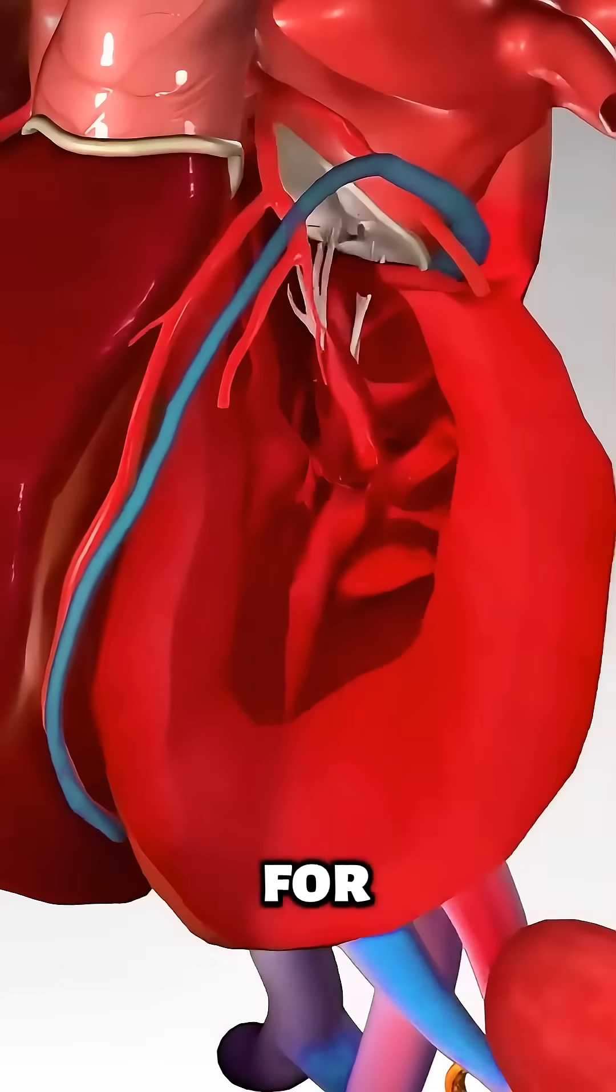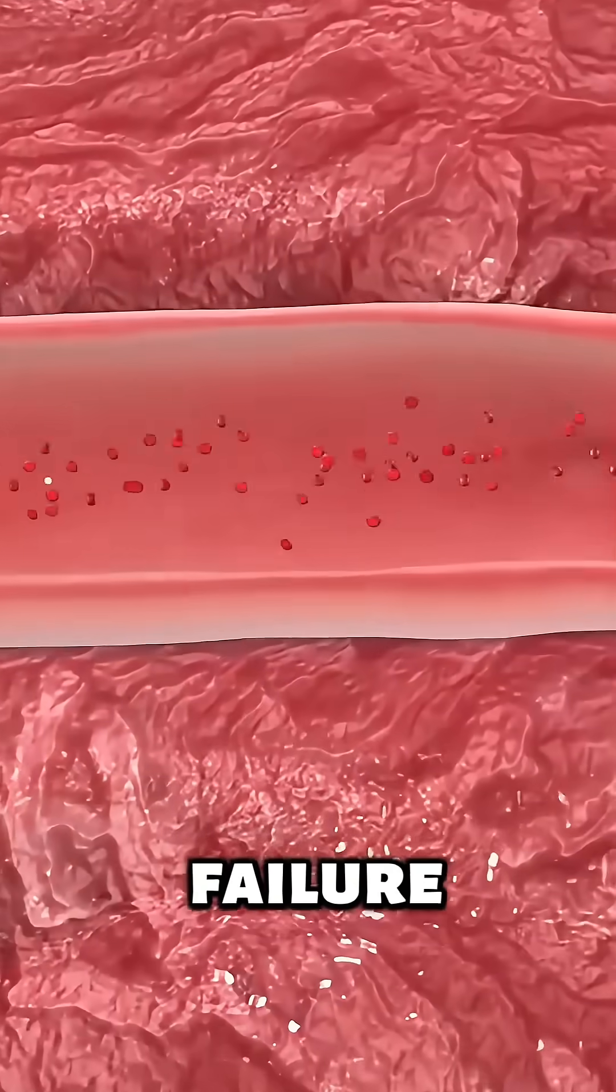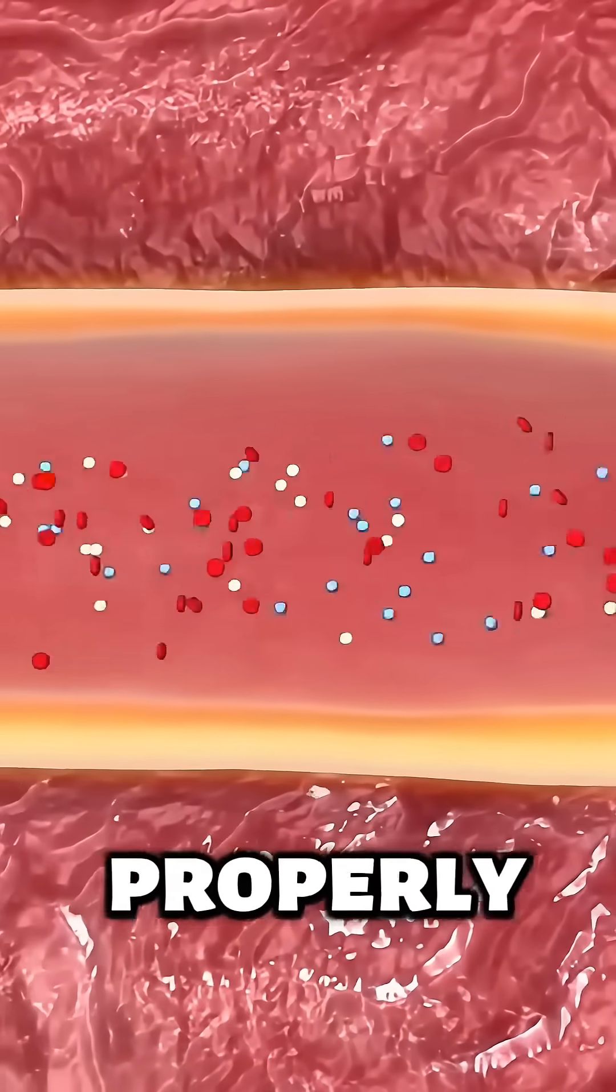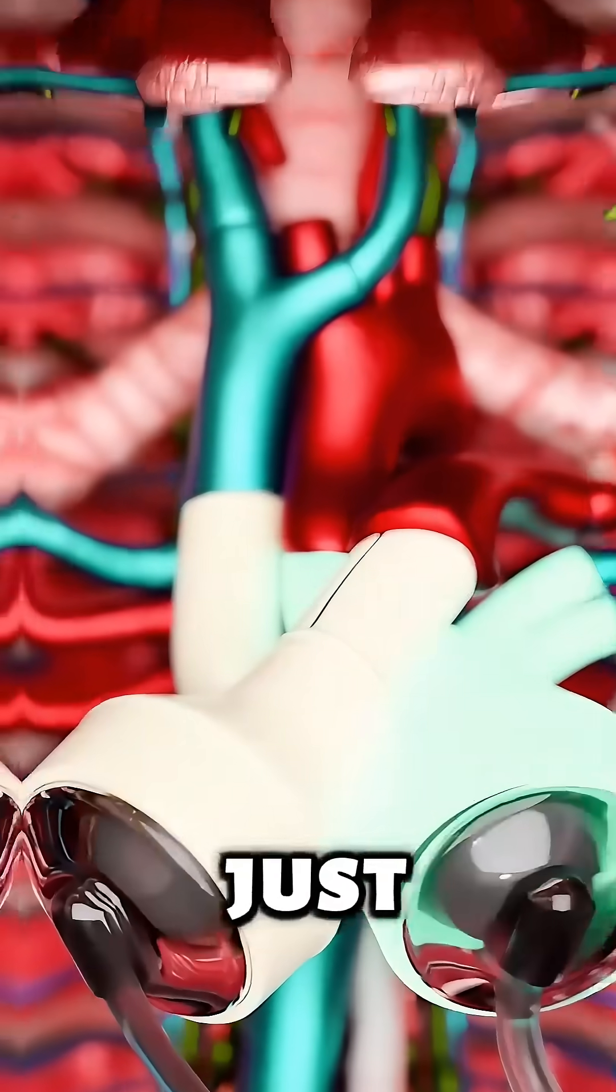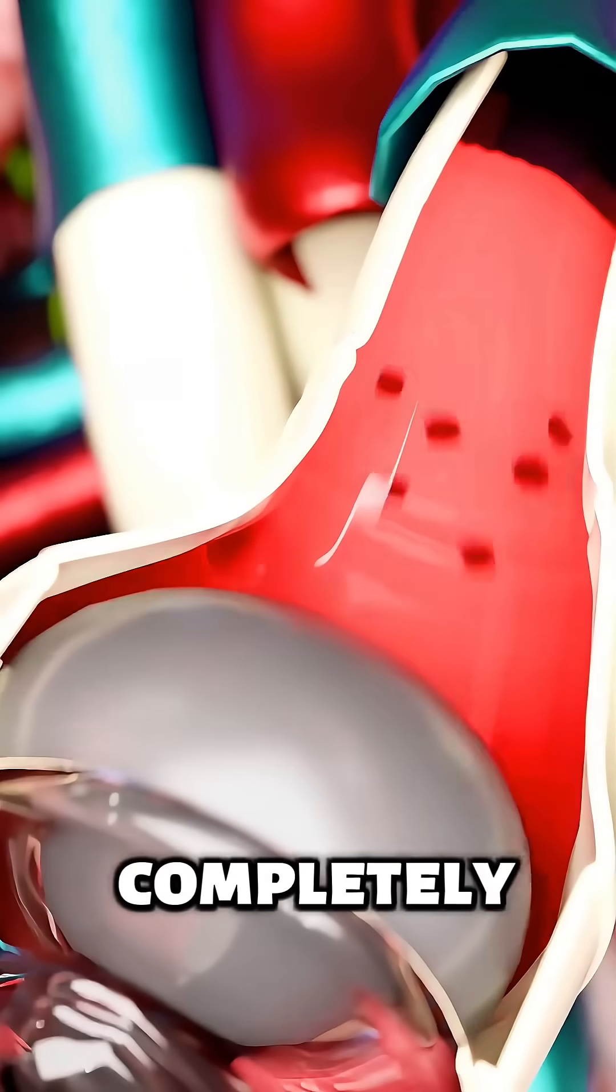This procedure is done for patients with severe heart failure when both sides of the heart can no longer pump blood properly. Unlike other treatments, TAH doesn't just support the heart, it completely replaces it.